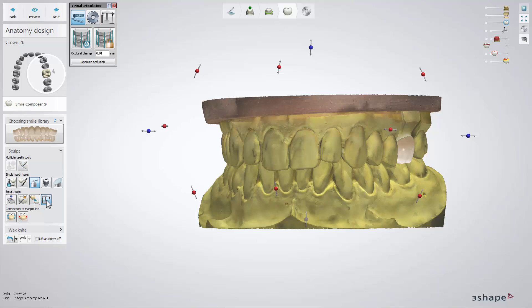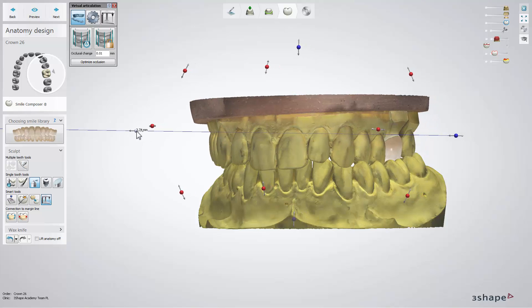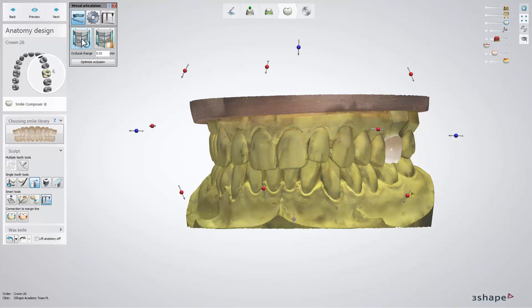If your scans are not aligned to the right occlusion, you can adjust their positions using the control points to drag the preparation scan. The virtual articulator is not shown during this process. To undo any changes and return to the original position, click the Reset to Current Static Occlusion button.